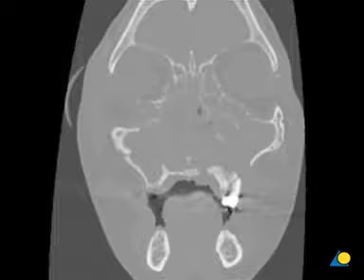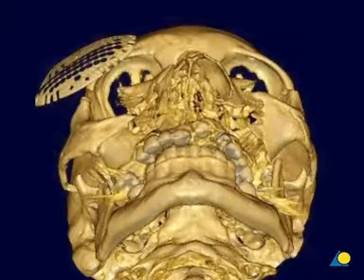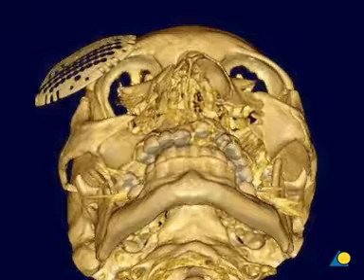For complex mid-face fractures and orbital floor fractures, preoperative CT scans in axial and coronal cuts are standard. Additional sagittal and three-dimensional reconstructions are often helpful. Radiographs may also be useful in certain circumstances.